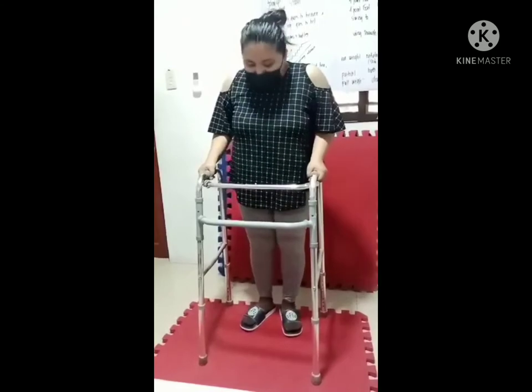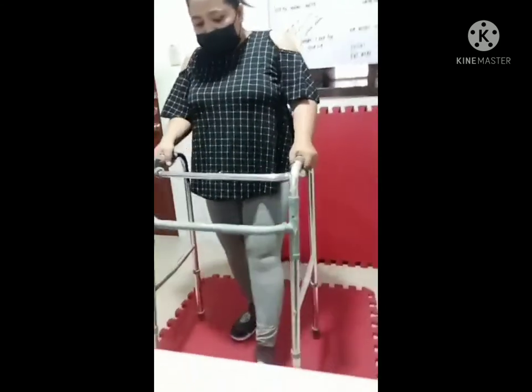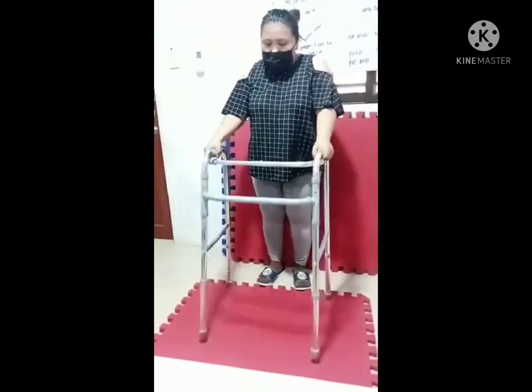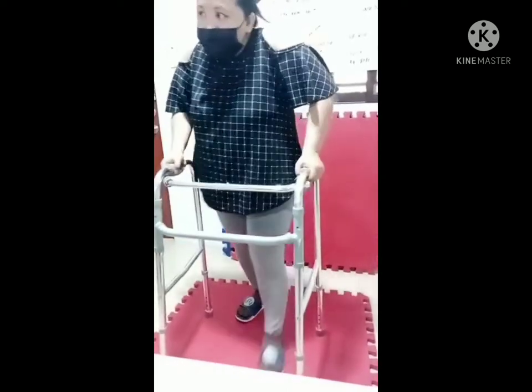Two-point gait: walker plus bad leg, good leg. Walker plus bad leg, good leg. Three-point gait: walker, bad, good. Walker, bad, good.